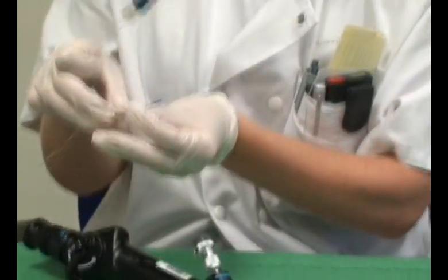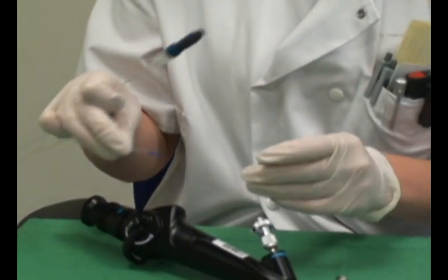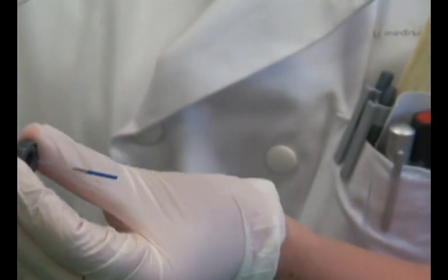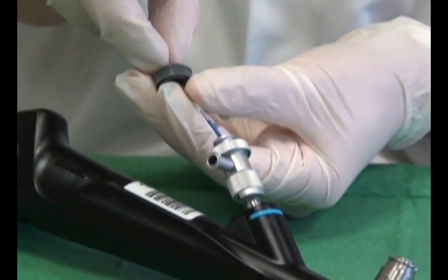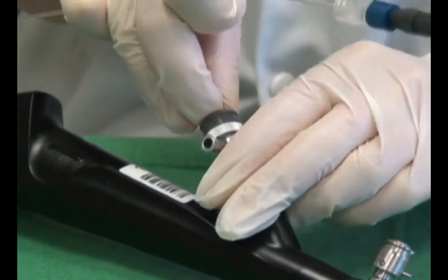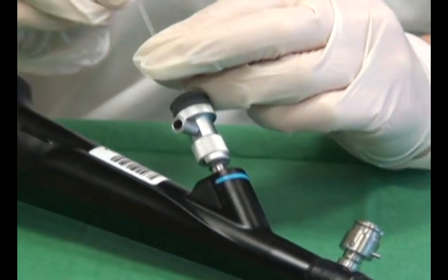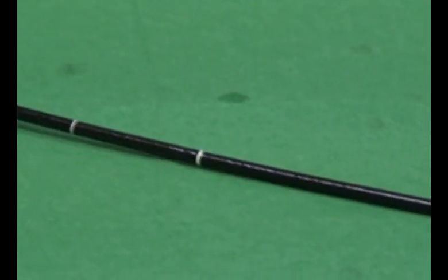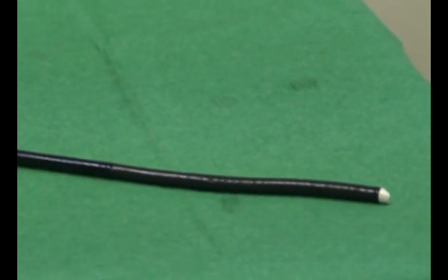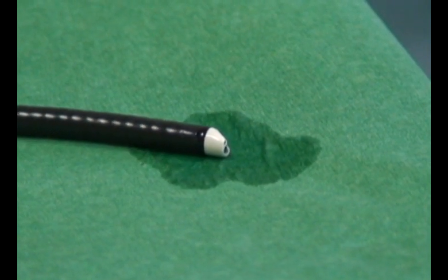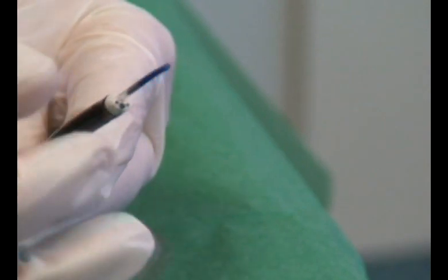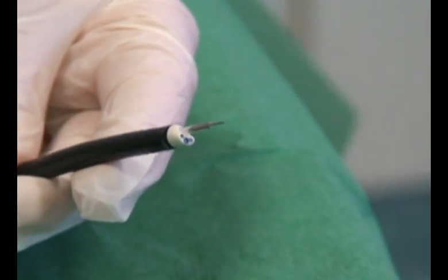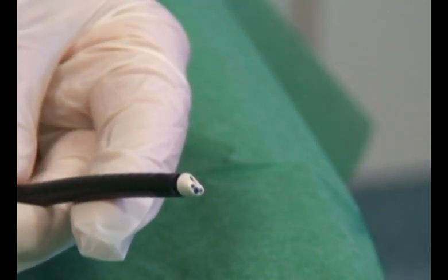The needle is inserted with its cap, first through the adapter, then through the working channel of the cystoscope. The adapter is then connected to the working channel to maintain water tightness. When it reaches the end of the scope, the cap is removed and the needle slightly retracted into the scope. The system comprising of the cystoscope and the needle is now ready for use.